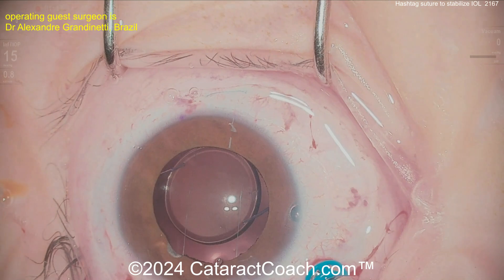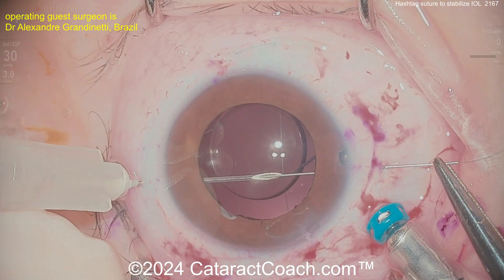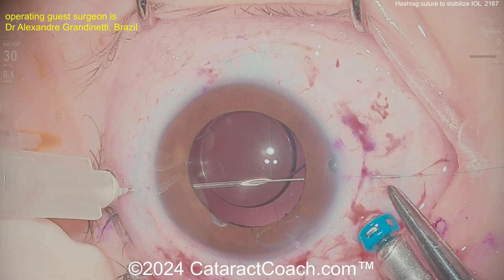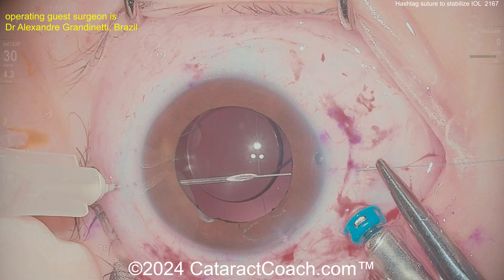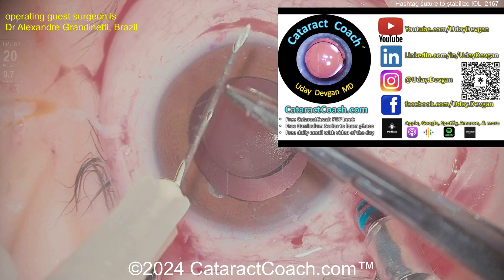I don't think this is going to have much of a visual effect, especially because it's not in the center of the pupil — it's out towards the periphery. And again, it's a very fine line; this is a 10-0, looks like polypropylene suture, and that'll be brought out of the eye.